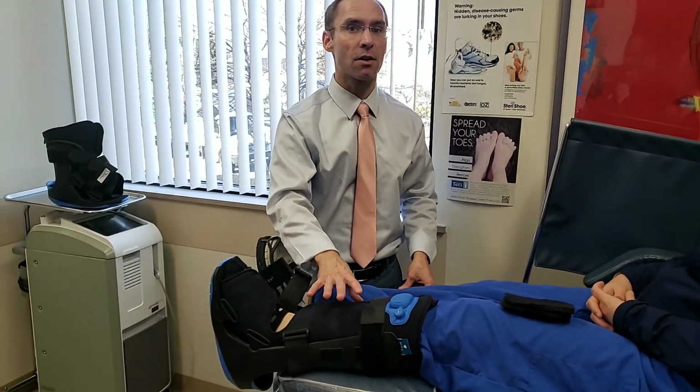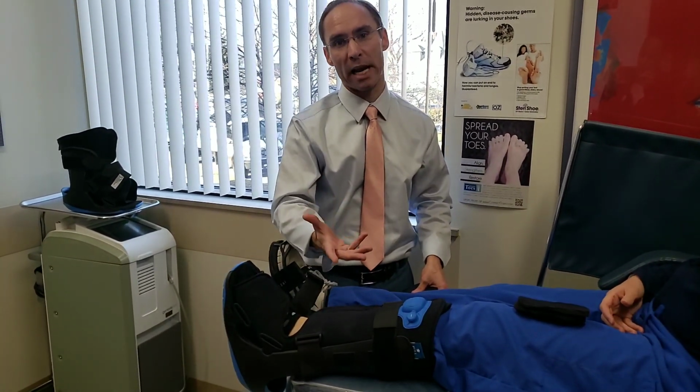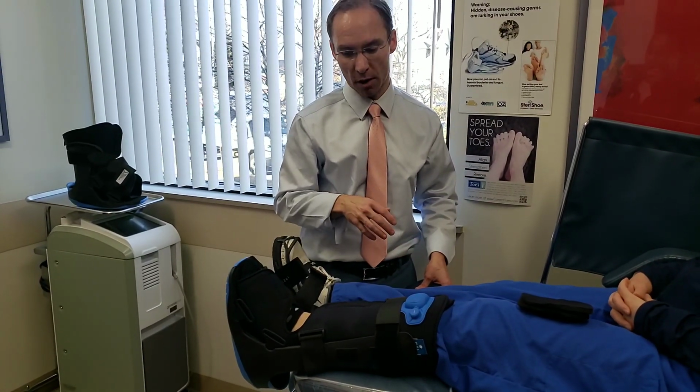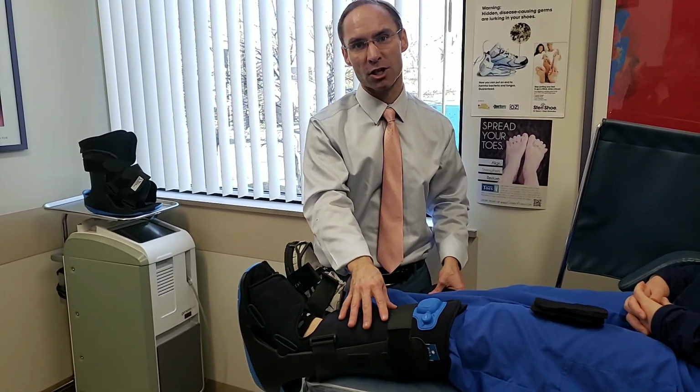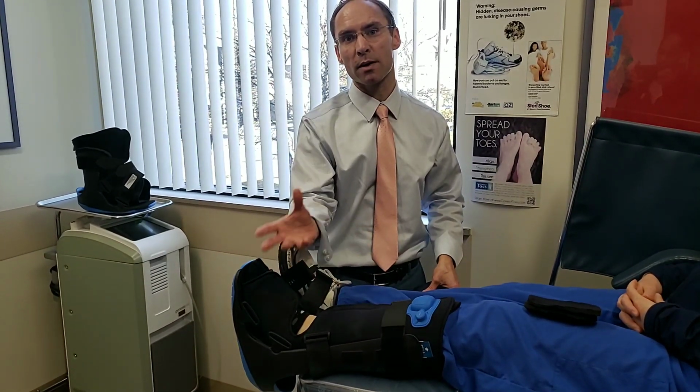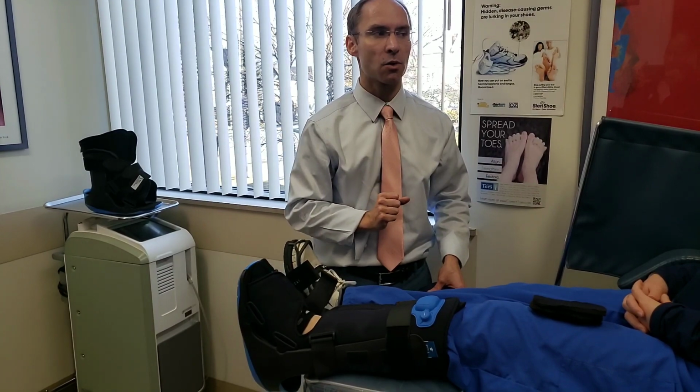If you're finding that these are helpful for you long term, you may have to make a brace to go with it. A brace can be used long term for certain conditions that this is going to help. The goal of this is to reduce inflammation and reduce pain. Once the pain goes away, then you can support it with either an orthotic or some type of a brace.